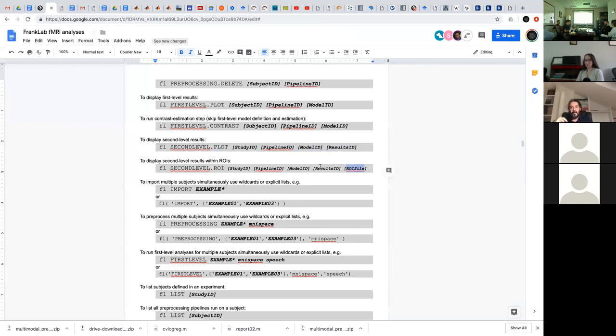You have something like thalamus, and you went and drew thalamus in this subject, and then you drew thalamus in this other subject, and then in the third subject, and so forth. But you don't have a whole brain transformation. You don't have a space where thalamus is all matched into the same voxel, so you don't have a common space. In those cases, you want to use subject-specific ROIs, because you want to extract that particular.